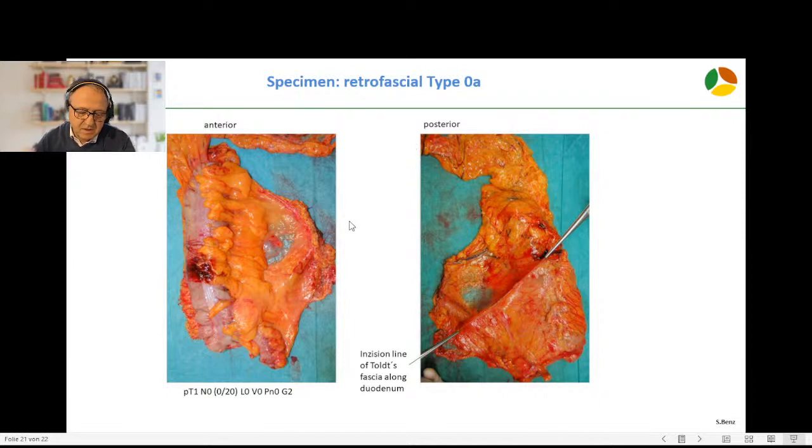This is the specimen of the operation. You see the peritoneal window surrounded by a robust trunk of mesenteric tissue. Iliocolic with the entire lymphatic drainage area. From the dorsal aspect you can see that the fascia really stayed on the specimen, protecting it against tumor spillage and resulting in a soft and smooth surface area. If you do it this way you really can see the fascia.